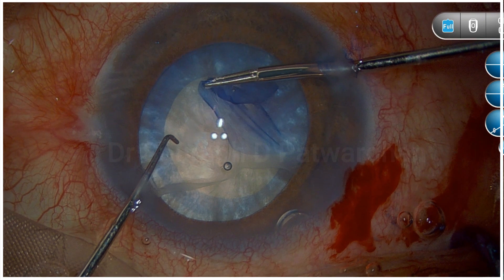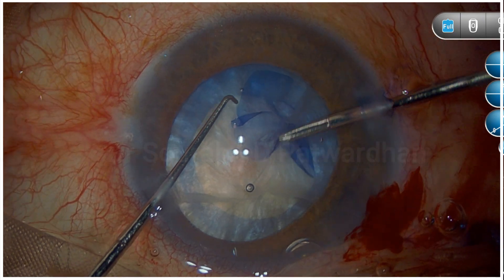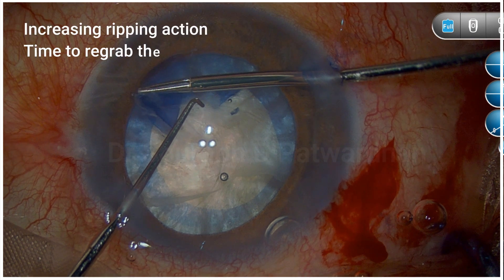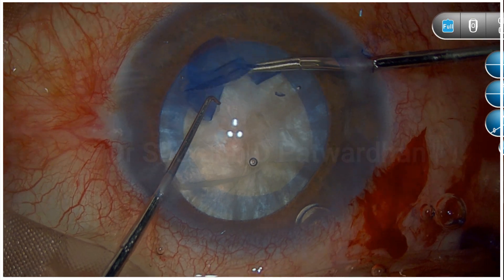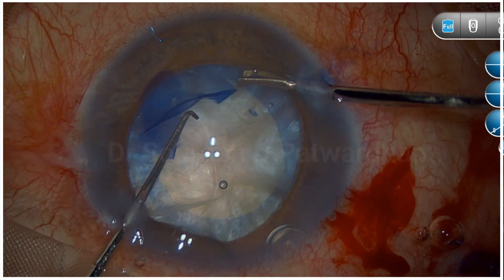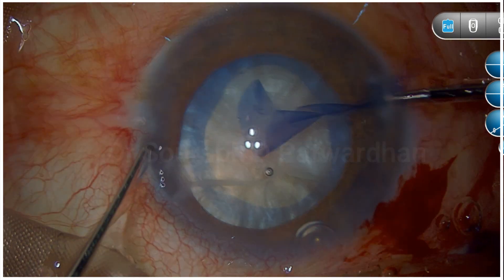Again I have re-held the tear. Here again you can see the ripping action is increasing — it's time to regrab. If you miss these points you are going to end up with more complications. So just watching the videos, and also when you are getting trained under supervision, you have to develop this thinking process.